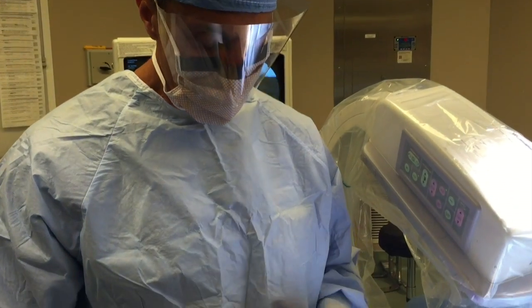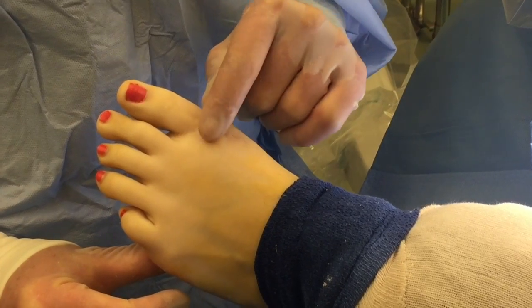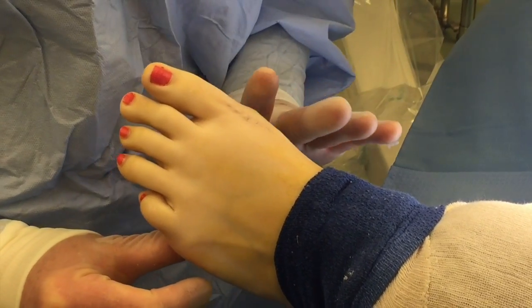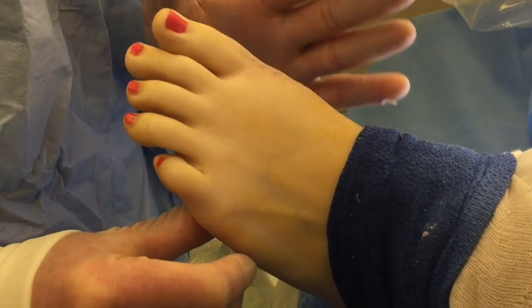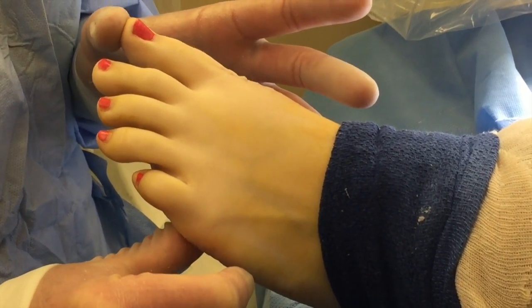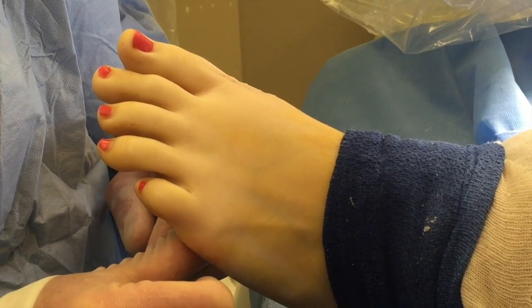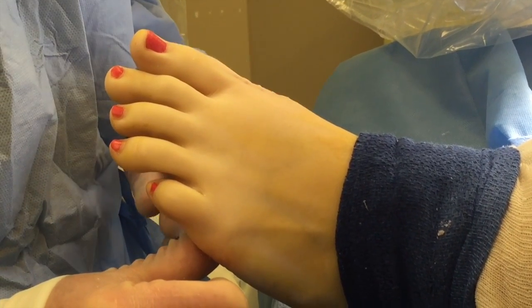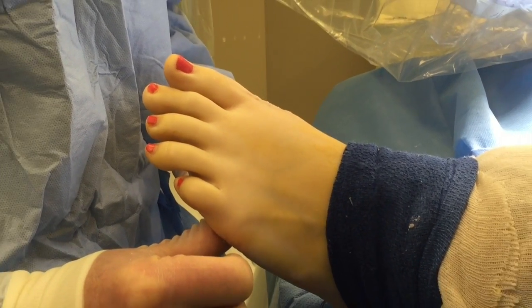Here we are done. The patient is sutured up, the pins are in. We did a subcuticular stitch and will put some Steri-Strips across the top. As you can see, it turned out wonderful — nice curvature, enough to get back in shoes, not too straight, not too far over. The TinFuse bone pins inside will absorb over a six to eight week period, and it should be fully weight-bearing by that time.